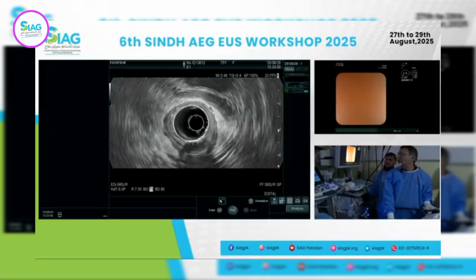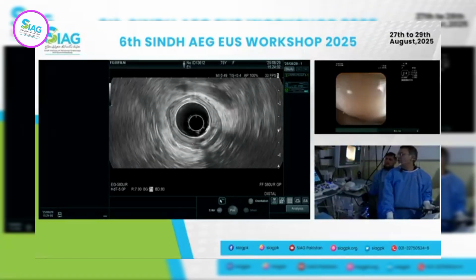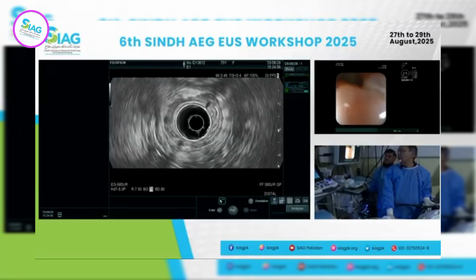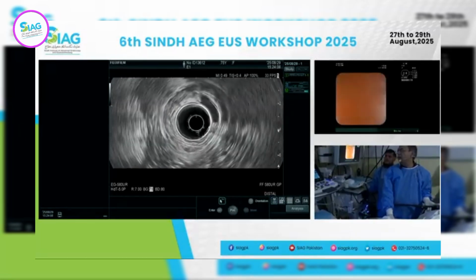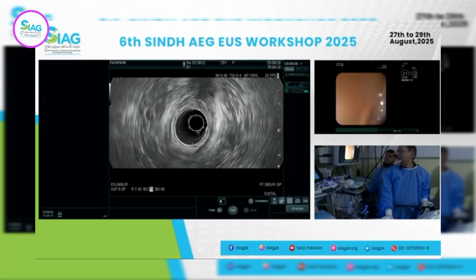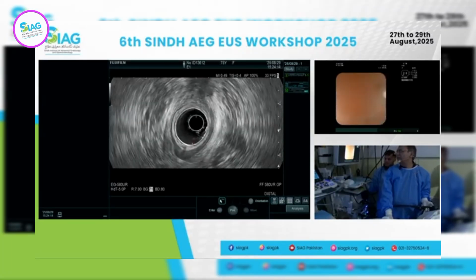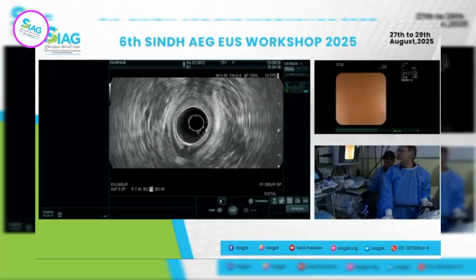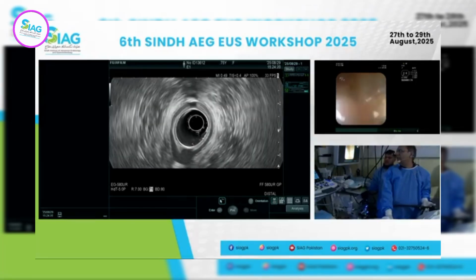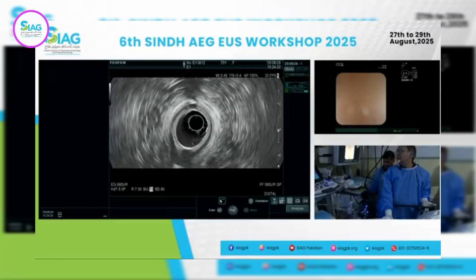We'll go to the sphincters now, internal and external sphincter. For the internal sphincter, you just follow the muscularis propria downwards towards the anal canal. You see it becomes a little bit thickened as you get closer to the anal canal. It's all very nicely intact.